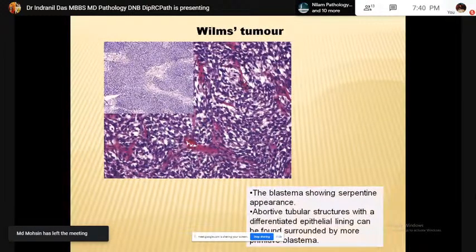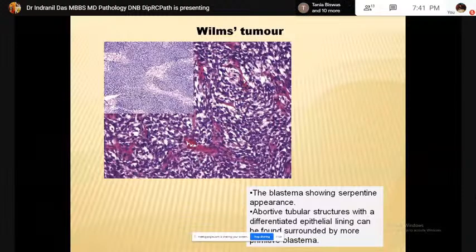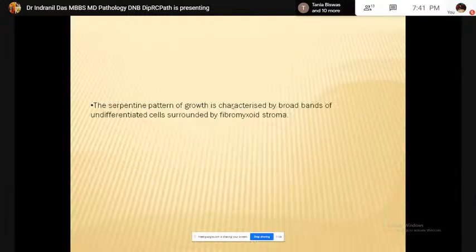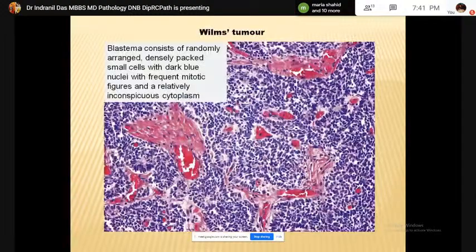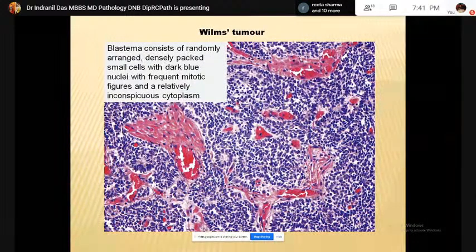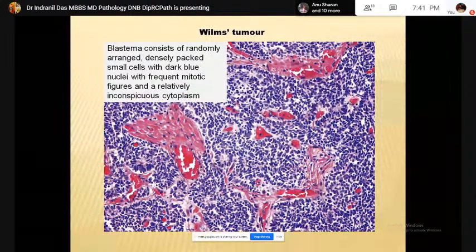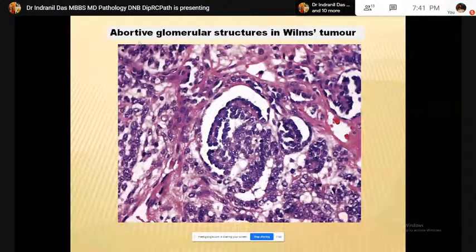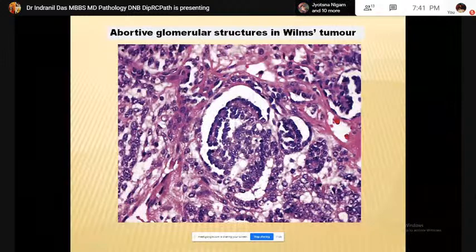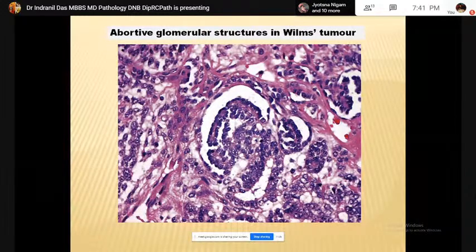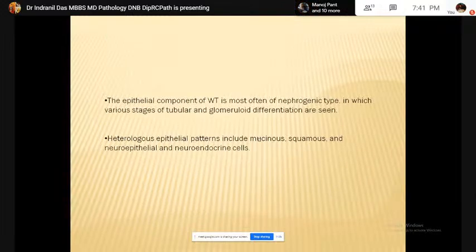This is a blastema-predominant tumor showing early epithelial differentiation. No criteria has been set to discriminate the blastema from early epithelial differentiation — this may be tubular or epithelial structures. In the basaloid variant, the nests of blastema have a distinctive peripheral palisade of elongated cells with epithelial differentiation. Diffuse and basaloid patterns lack the pseudocapsule and may infiltrate into the surrounding tissue. Here the blastema is showing a serpentine appearance, with aborted tubular structures with a differentiated epithelial lining.